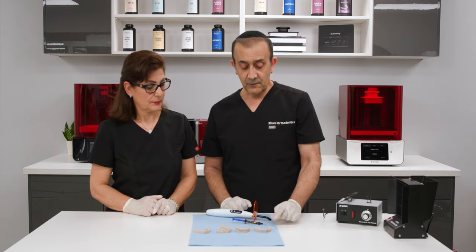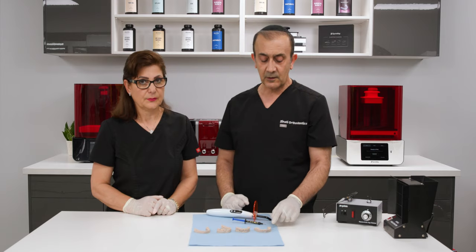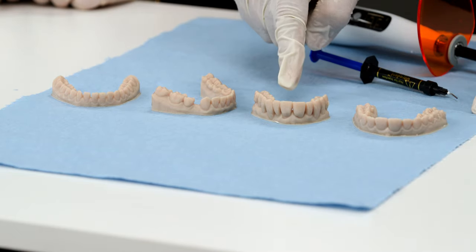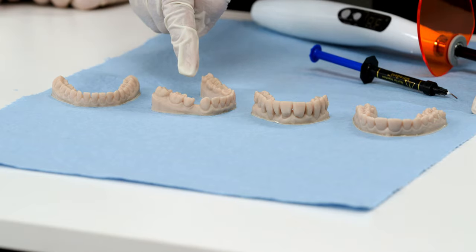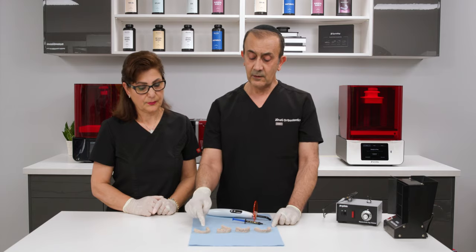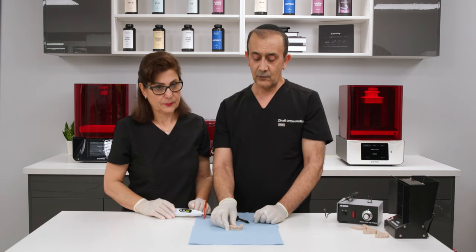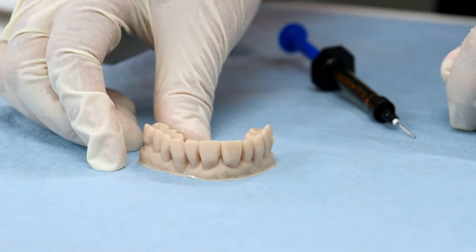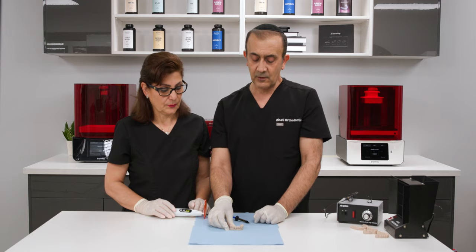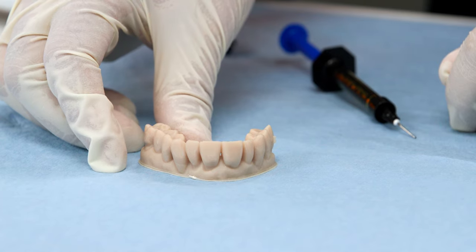We have four models here. The first is an ideal model with the base cut to exactly 15 millimeters from the incisal edge. The second is a periodontal case with a lot of gum recession. The third is a missing tooth case. The fourth is an anterior spacing case. Looking closely at the periodontal case, you can see a lot of interproximal recession, and we need to make sure the thermoplastic material doesn't get caught underneath those undercuts.